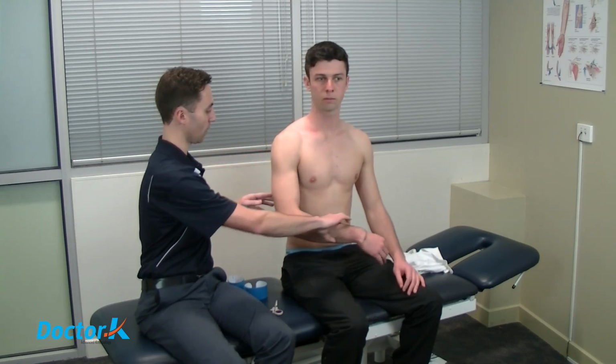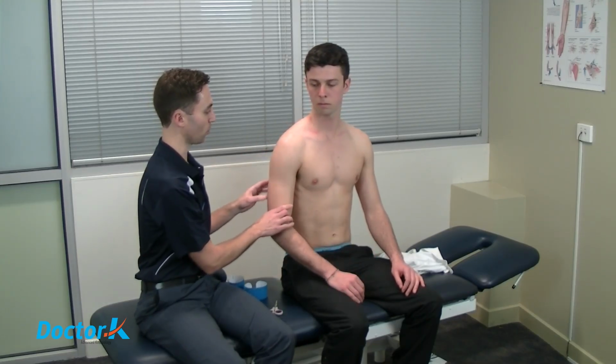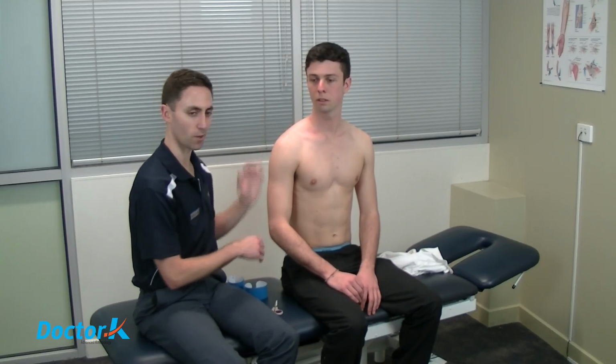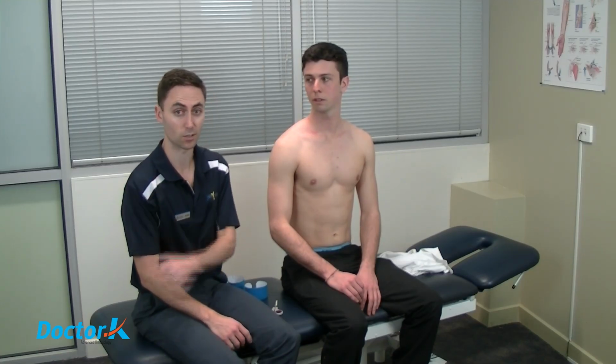And then when we're doing our back piece, we're going to reach across your chest so we can run around with that area lengthened. And then we're probably going to try and be more neutral where possible when we're doing the one across the front, but you'll have to adjust your arm position so you can reach around the back to some extent anyway. It's also effective with this particular technique to look at yourself in the mirror so you can see what you're doing too.